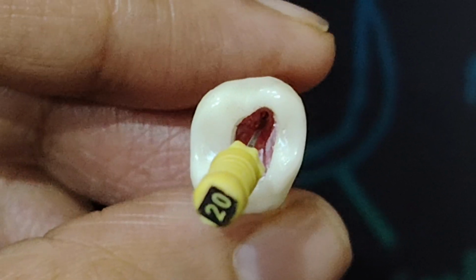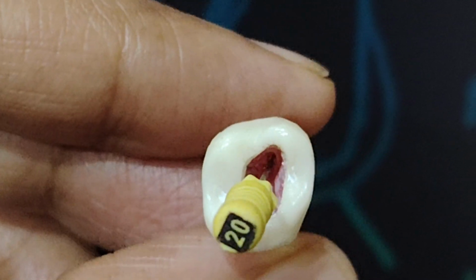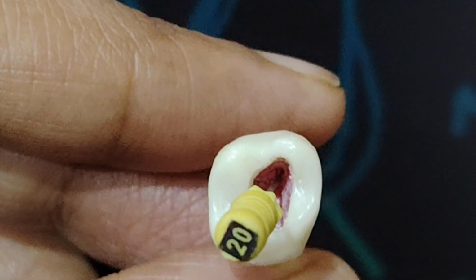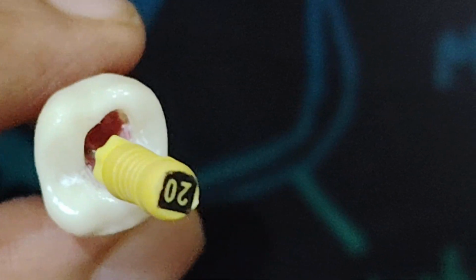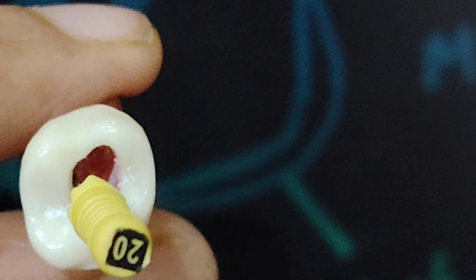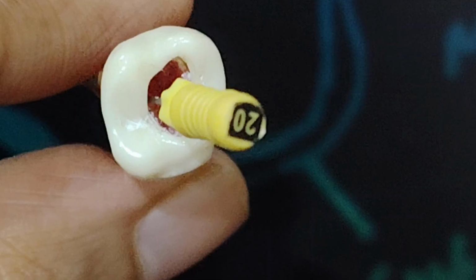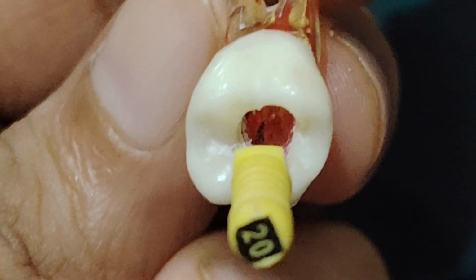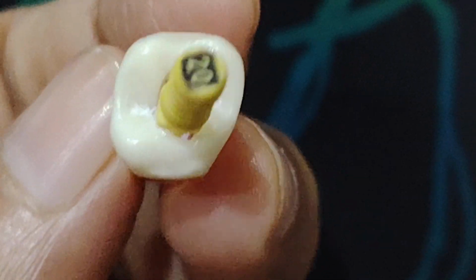We can appreciate that this is the mesiobuccal canal in which I have put this file. Now you can appreciate that's the distobuccal canal in which I have put the file. This is the palatal canal in which I have put this file.